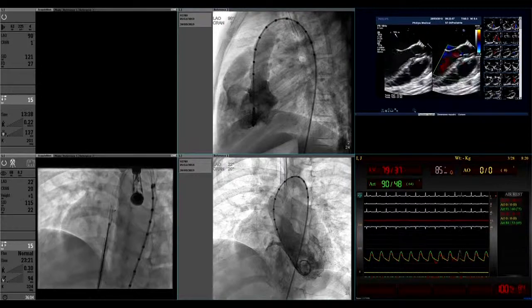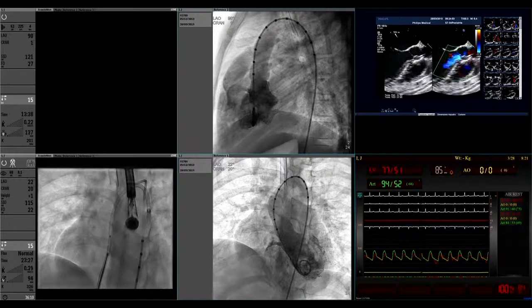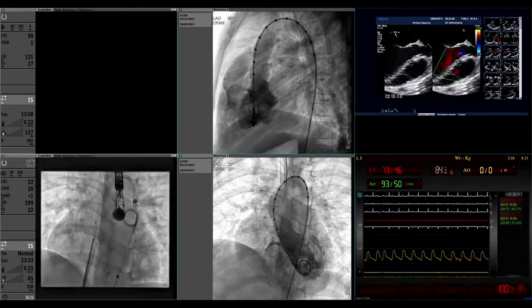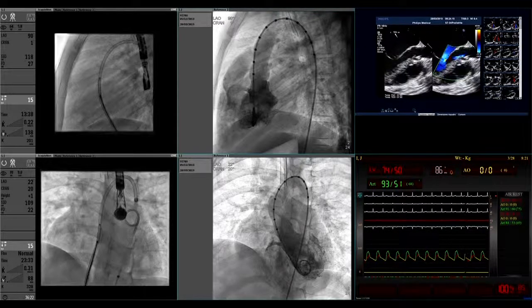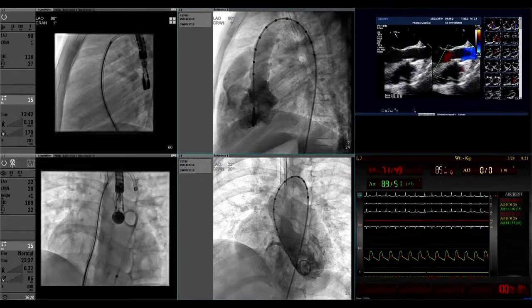So I think you could get away either with the 5 or a 6 LifeTech device. But after Tin demonstrated this nice angle, I think a 5 would work like a charm here. But let's see. I mean, that's great. I've never used the ADO1 to close the VSD. Everybody uses it, but yeah, I think it would be fine.